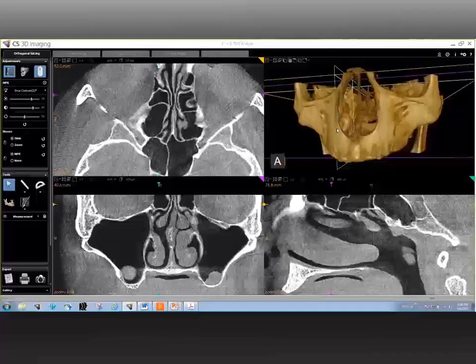Okay. Well, let me get back to what we were on, an interesting aside that we got on. And I do think it's important to point out not just the benefits of cone beam CT, but as we have mentioned here, some of the limitations. But let's go back into the subject, and let me ask you another question. What are the most important landmarks to be considered while planning for implant surgery in the maxillary jaw?